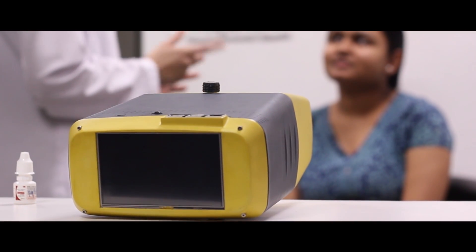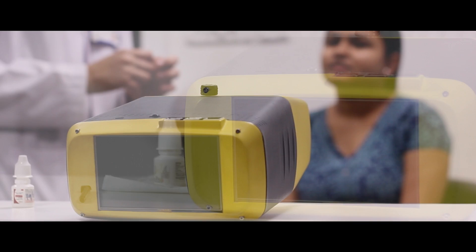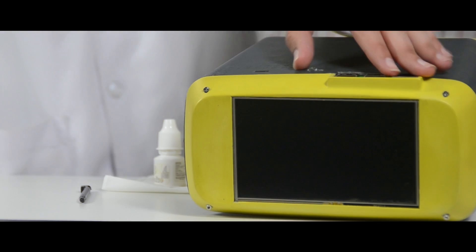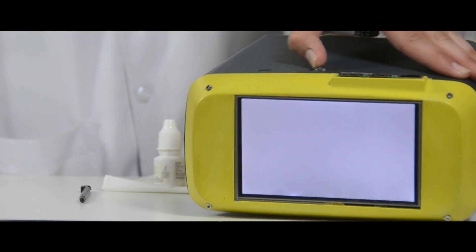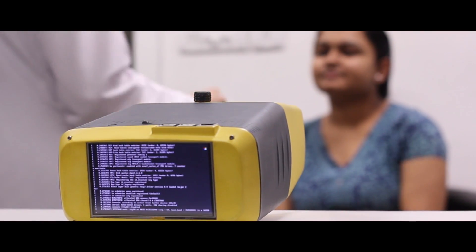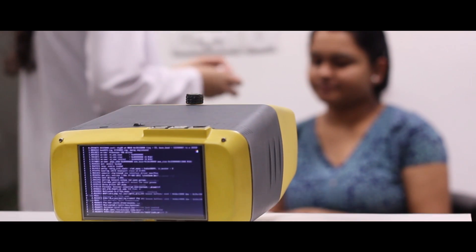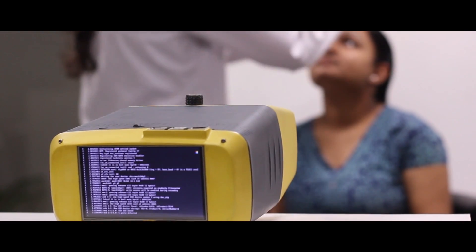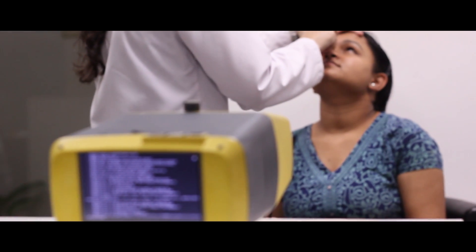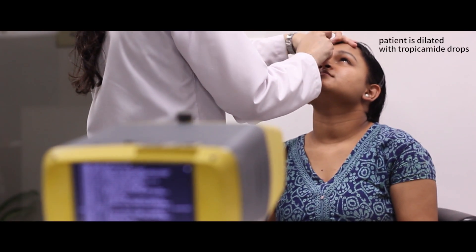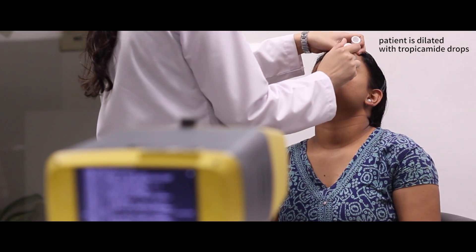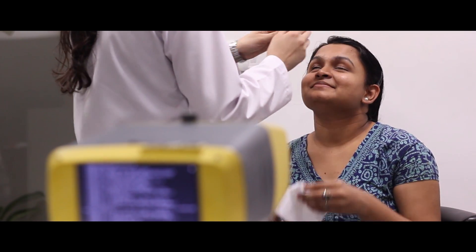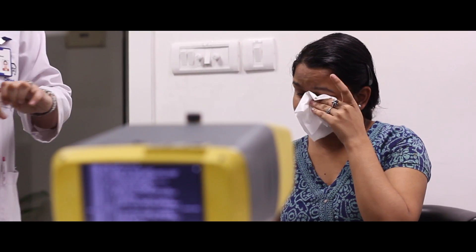The OIO's simple three-step process of focus, click and upload is intuitive enough to allow anyone to conduct a test. The machine learning API grades the images of the retina and provides an accurate diagnosis. And with this, the OIO only gets better at diagnosing diabetic retinopathy with every use.